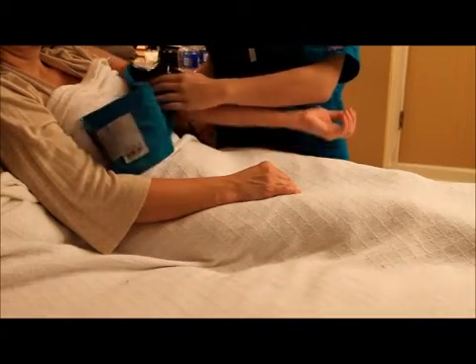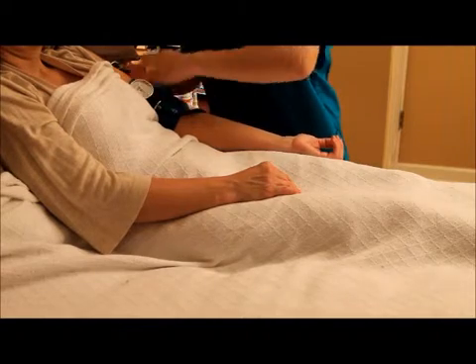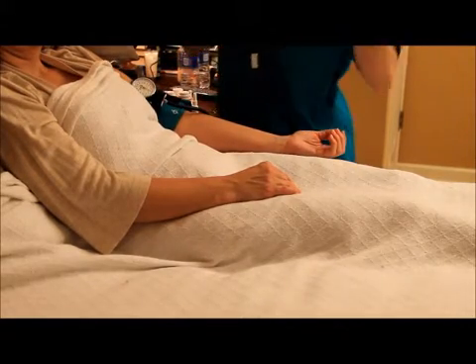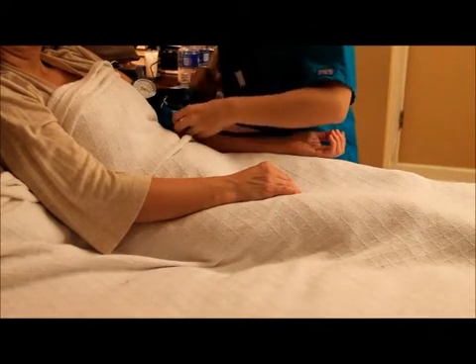Next, wrap your blood pressure cuff around the upper arm. Then, place your stethoscope under the blood pressure cuff where you found the pulse.